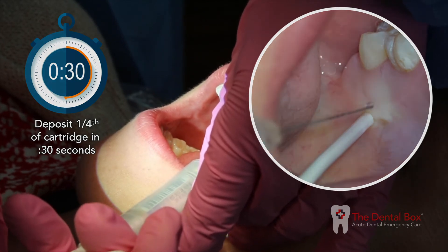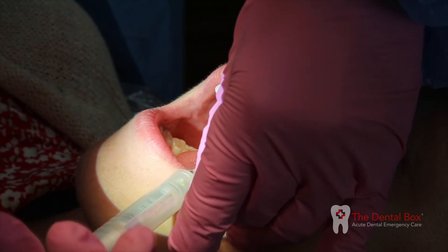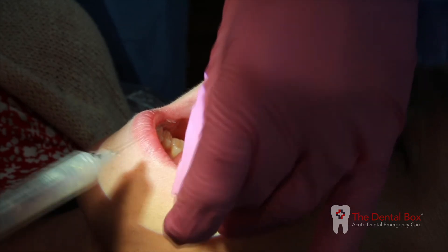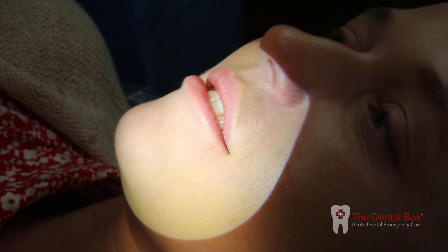Withdraw the syringe and cap the needle. Wait two to three minutes for soft tissue anesthesia to set in.